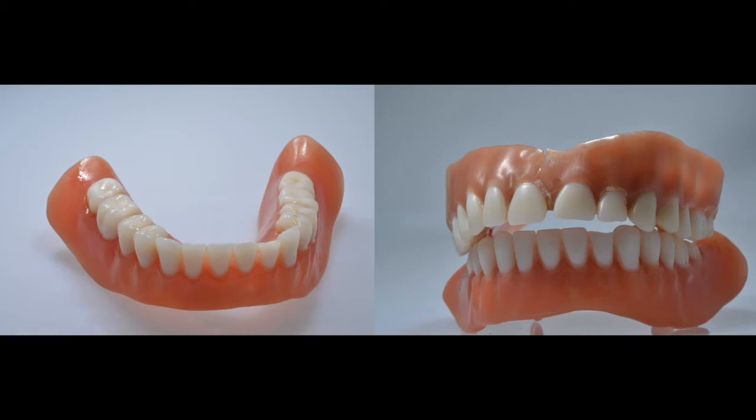Please take a look carefully at this mandibular and maxillary denture. At the end of the session, I'm going to show you the same picture again and see whether you will be able to identify which outline form was incorrectly formed in this particular case.